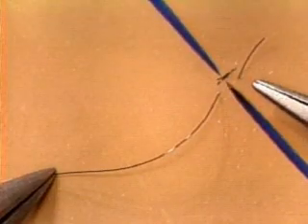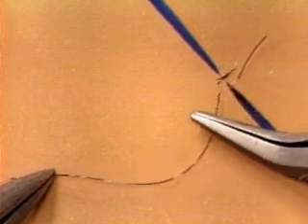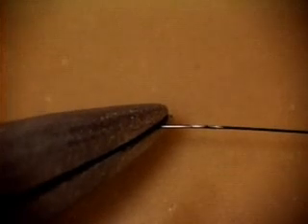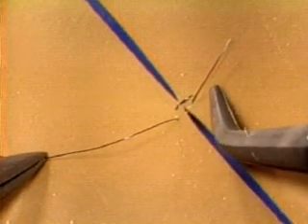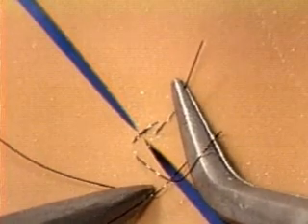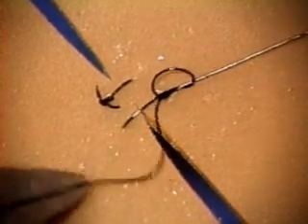We're almost at the end of the tape, so let's just review the most important points from the second half of the tape. Arrange just the right length of thread for the short end and for the loop. Always pick up the long end so that the loop length emerges from the side of your forceps that you can see. Before making the loop, set up the direction of the right-hand forceps so that with the loop made, you'll have no problem picking up the short end. Finally, use the sliding maneuver to avoid premature locking.